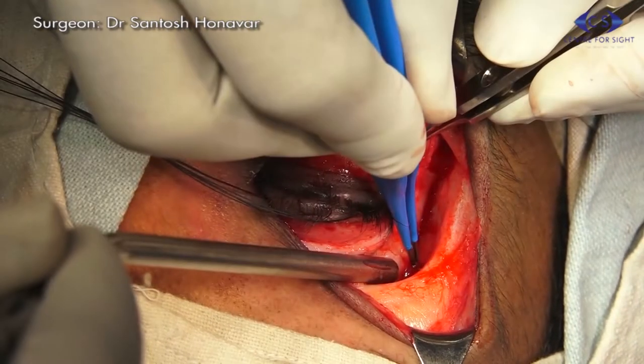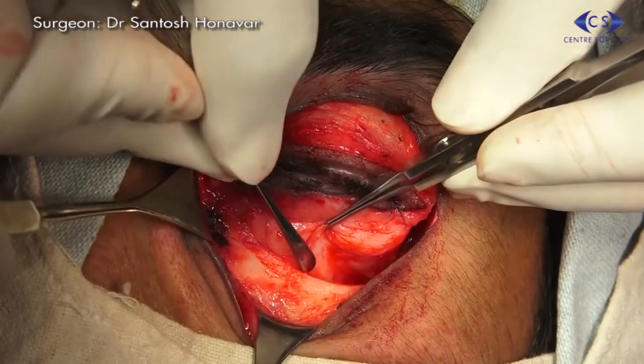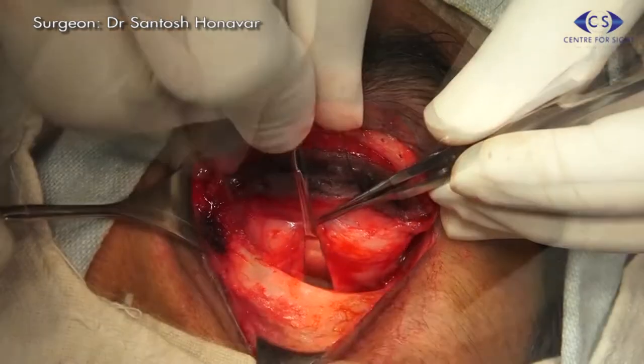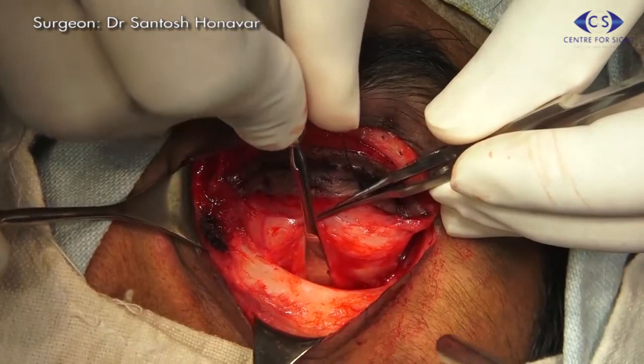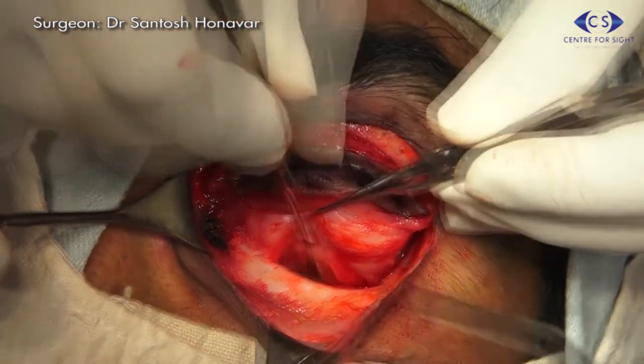Dissection should be performed carefully along the orbital floor so as to not fracture the thin bone and create a communication with the maxillary sinus.